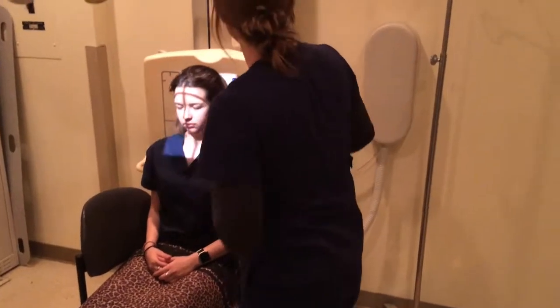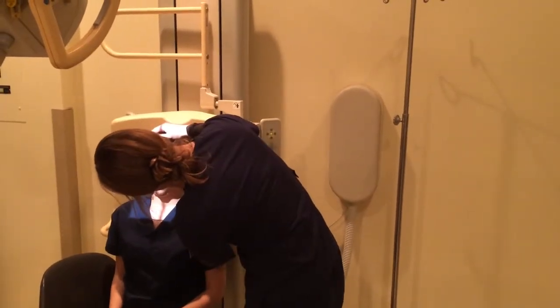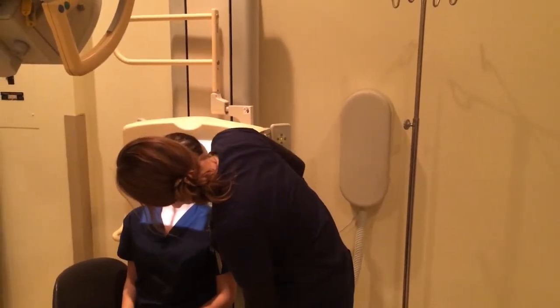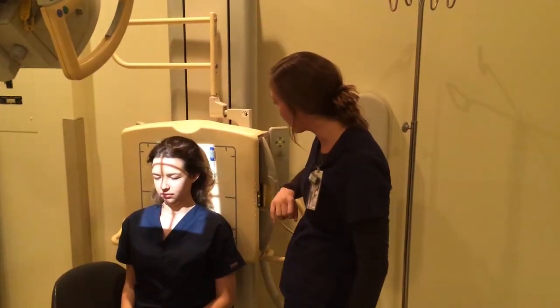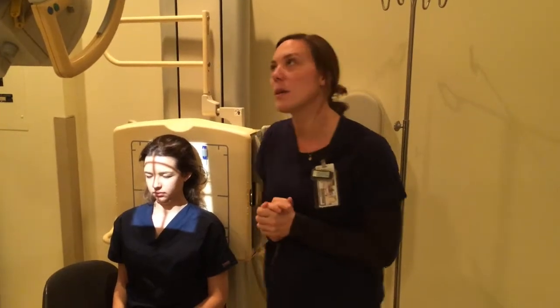We're using a 10 by 12 portrait. Our central ray is going to be 2 inches superior to the glabella. The MSP as well as the OML is perpendicular to the IR, and we've marked it with our patient's left side. The technique that I've set on my console is 85 kVp, 14 to 16 mAs.